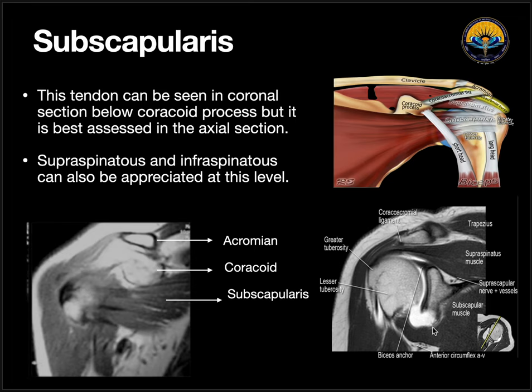Next is the subscapularis tendon. The subscapularis tendon can be seen below the coracoid process. Just as we look for the acromioclavicular joint and see supraspinatus below it, for subscapularis we find the coracoid process and see subscapularis muscle below it. To see subscapularis more beautifully, we use axial sections, where we can see the subscapularis muscle, its tendon, and its insertion on the lesser tuberosity.